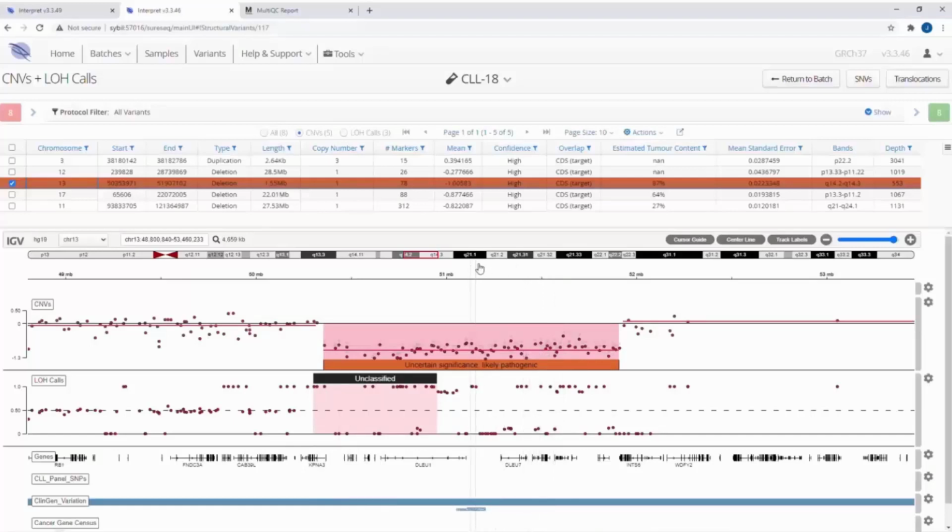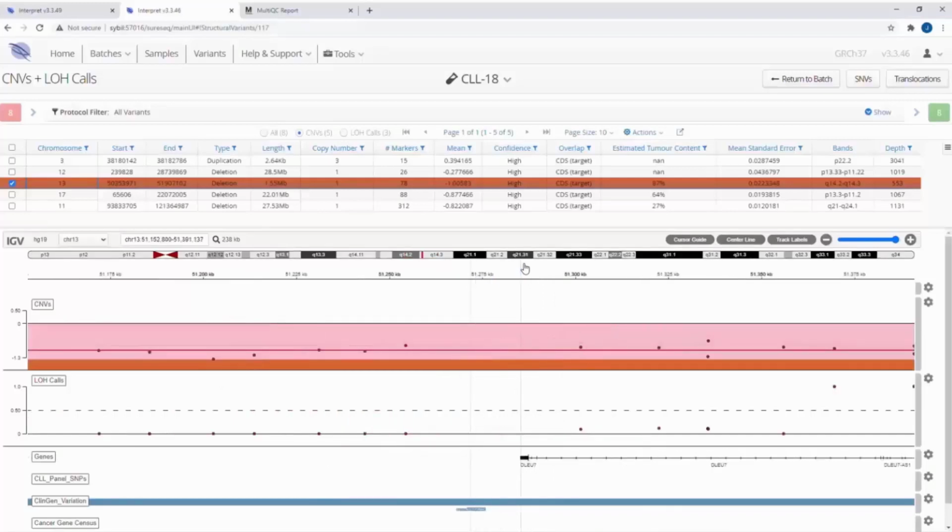And I'd like to quickly zoom in on here. I don't know if it's going to be possible to view, but you'll see the red dots. For each red dot there is a grey dot just above it, and that grey dot is the original data, and this red dot is the corrected data. And this is something quite innovative, and we've implemented it by estimating the tumor content.